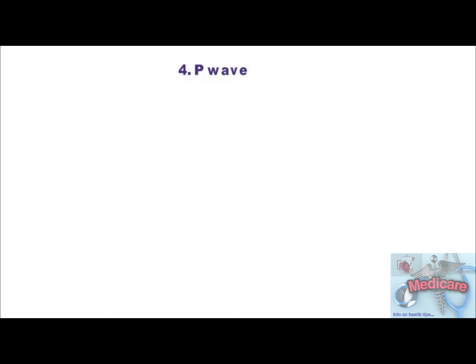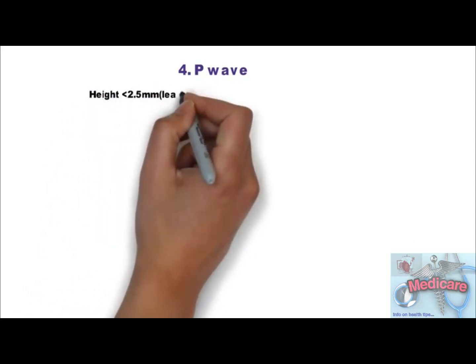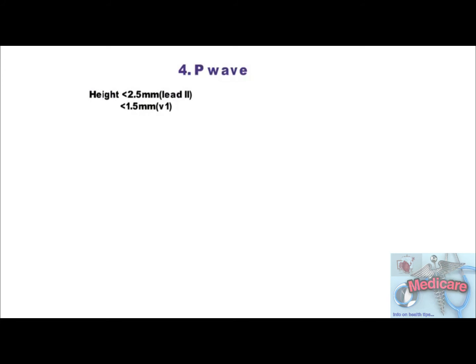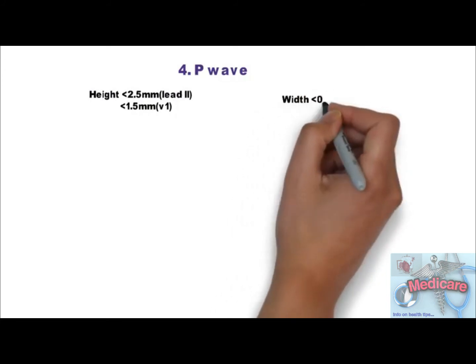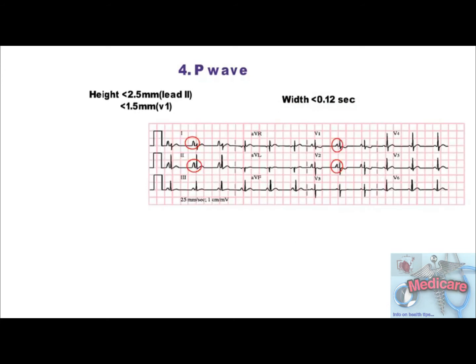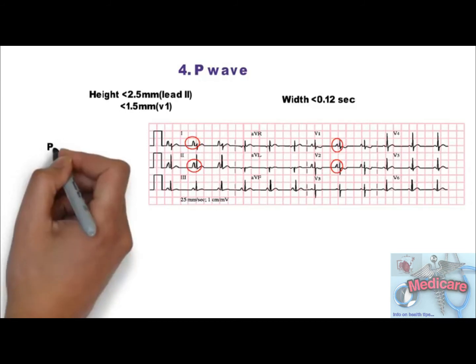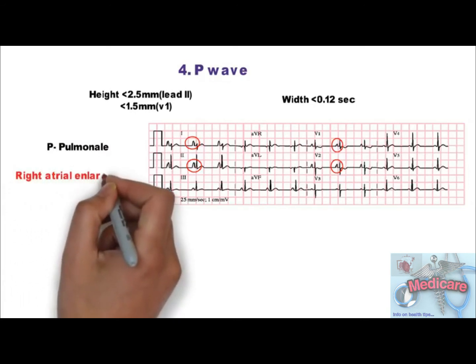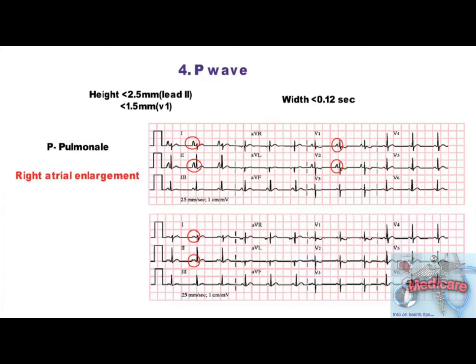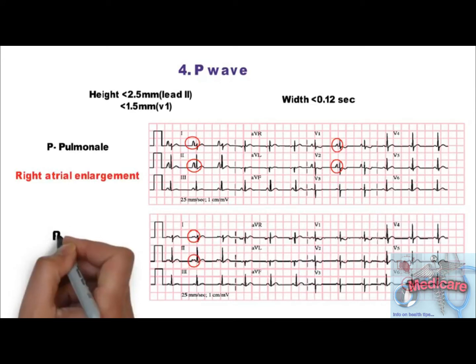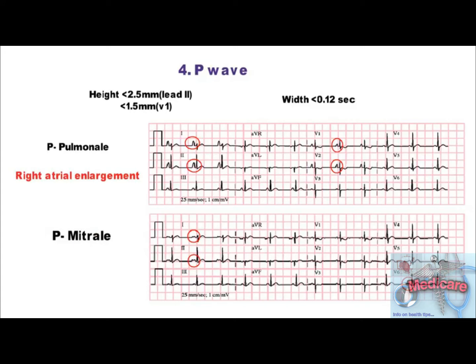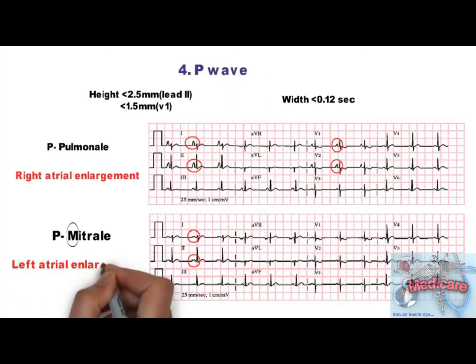Step 4 is P wave. First, see whether P wave is present or not; if present, examine the morphology. For P wave morphology, look at lead 2 and V1. Height of a normal P wave is less than 2.5 mm in limb leads and less than 1.5 mm in precordial leads, and the width should be less than 0.12 seconds. In this ECG, P waves in lead 1 are tall and peaked — these are called P-pulmonale, seen in right atrial enlargement. If P waves are bifid or have a notch, it is called P-mitrale, remembered by its M-shape, seen in left atrial enlargement.